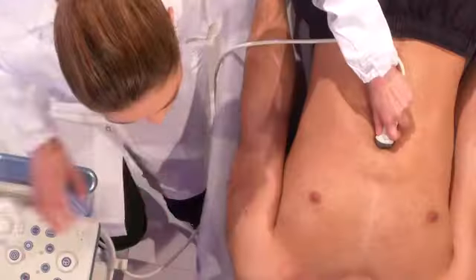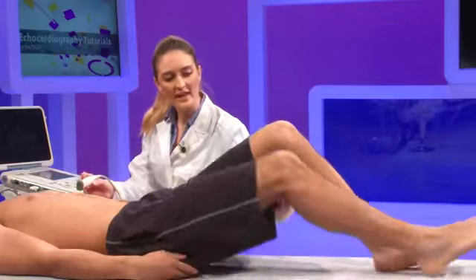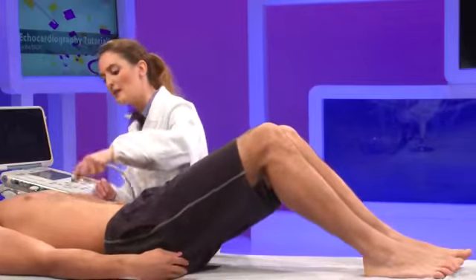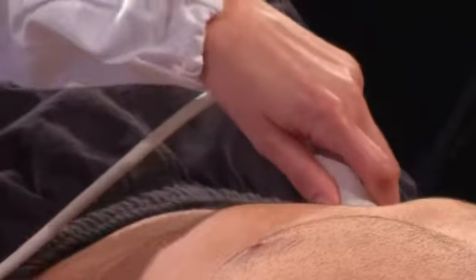In case you cannot easily find the inferior vena cava, and if your patient is compliant and can do that, you can ask the patient to lift the legs like this, and then you can more easily scan the subcostal view like this.